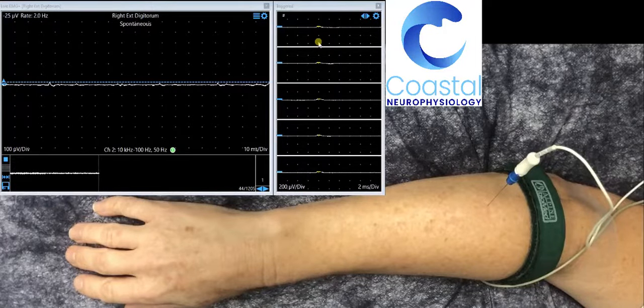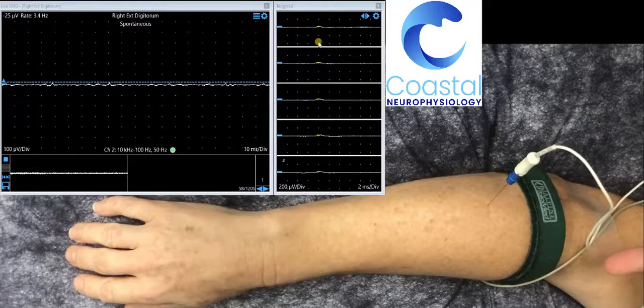In this example, we have a volunteer who has a needle electrode placed in one of the muscles that extend her fingers of her right hand. There is a green strap on her wrist — this is an earth strap. You can see a white cable which runs through here, and attached to it is a disposable needle electrode.